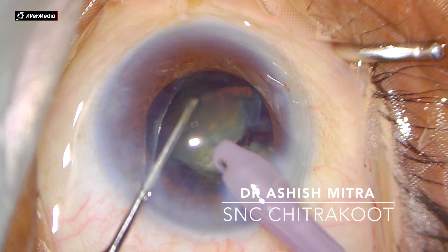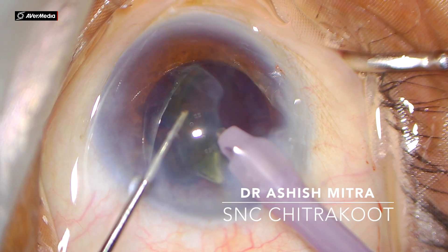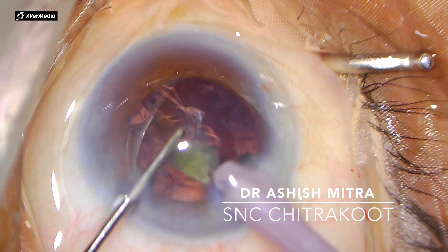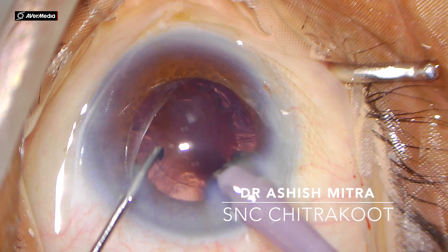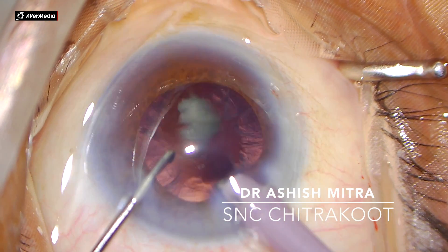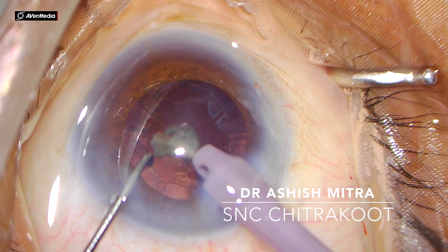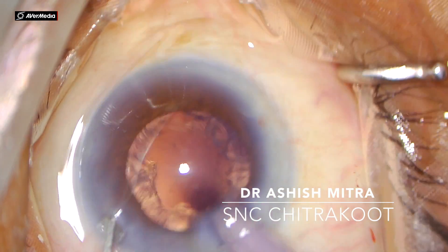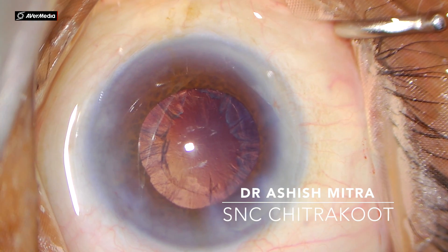With higher-end machines available these days, the chopping and emulsifying is actually very efficient and easy — although I have no financial interest in any. Now you can see this is the last piece left; you have to deliver power in pulses. I was able to emulsify the nucleus very well. The rhexis margin is visible and leftover cortex is visible.